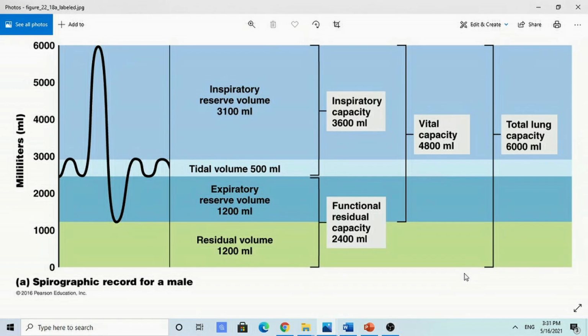The reason why the volume of air we breathe in and out needs to be measured is because this volume changes during disease. If people suffer from respiratory illness, the maximum volume of air in a sick patient, someone whose respiratory system is sick, decreases or changes. So spirometry, being a method of measuring respiratory volume, helps to diagnose diseases.